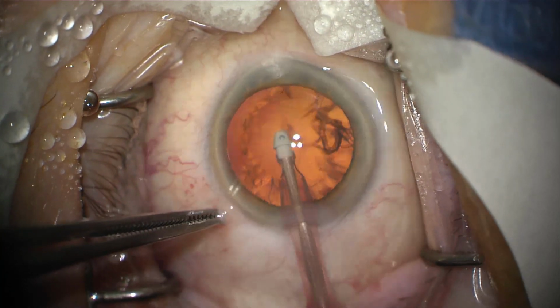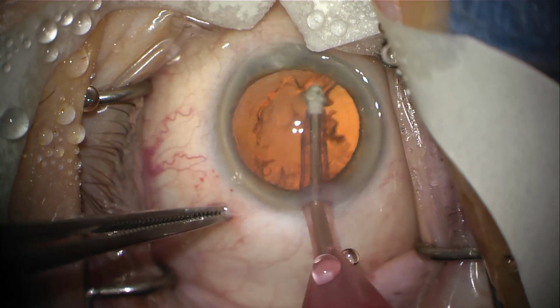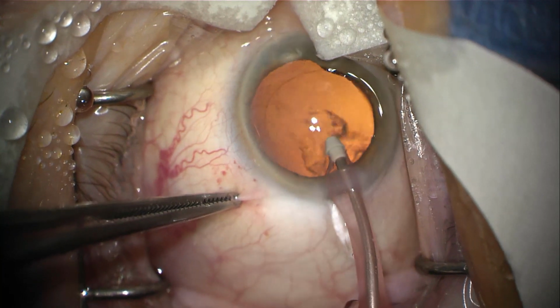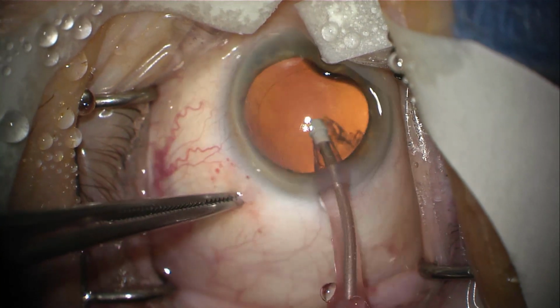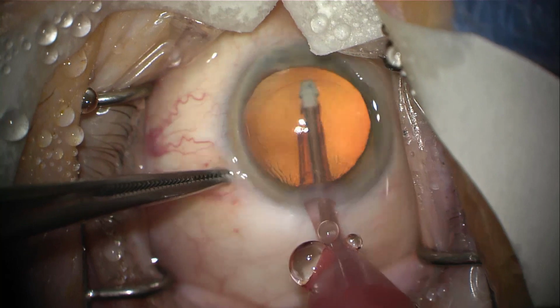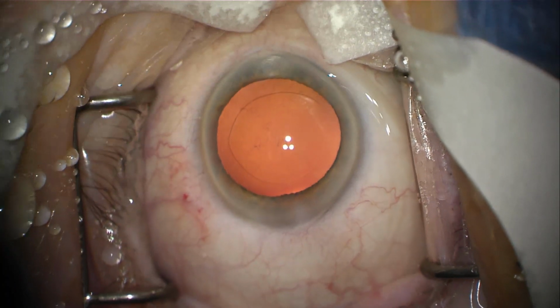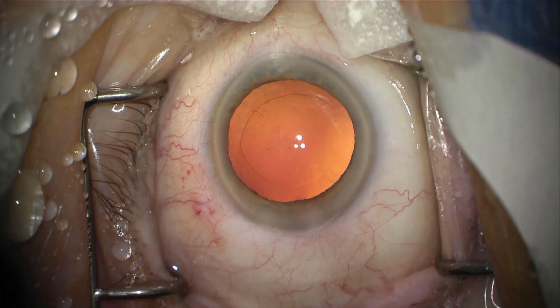These are attached to the capsule, which is 15 microns thick, so I have to be extremely careful not to touch that capsule. And as you can see, I've gotten all of it out at this point, so that now I've evacuated the entire cataract from its capsule. I've evacuated all of the chocolate out of the M&M. All that remains is a candy shell.